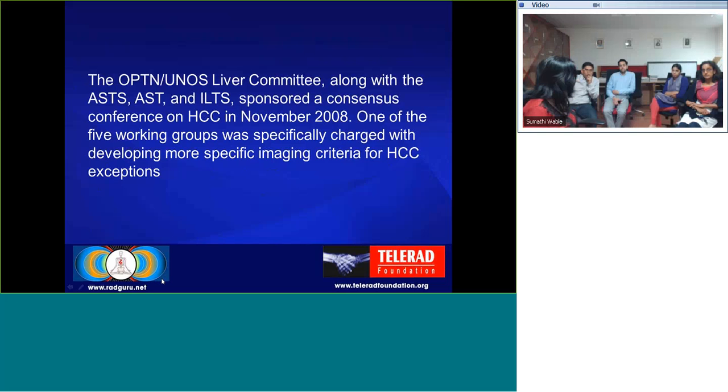So in all tertiary care centers, we have to follow these criteria guidelines developed by this committee, which is like you cannot, for example, just scan a liver on a 0.3 or a 0.5 Tesla magnet. You cannot just scan a liver and do like a 7 millimeter slice.